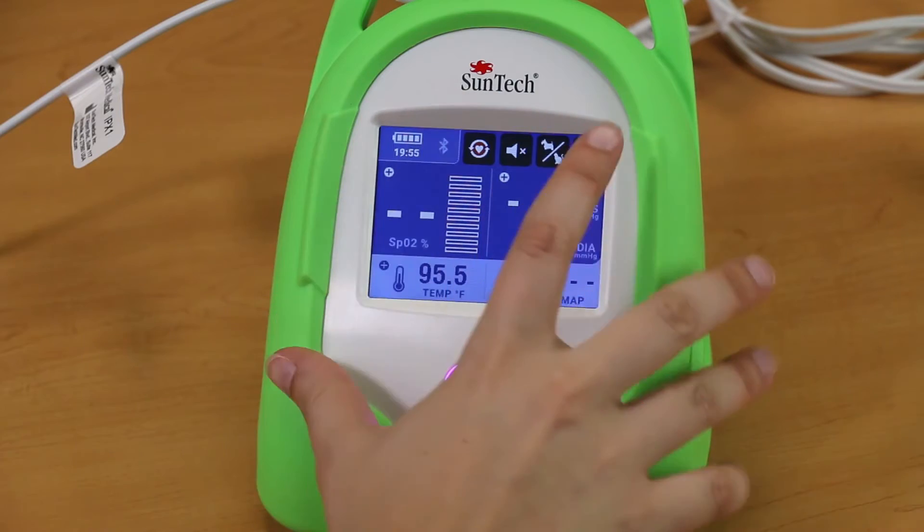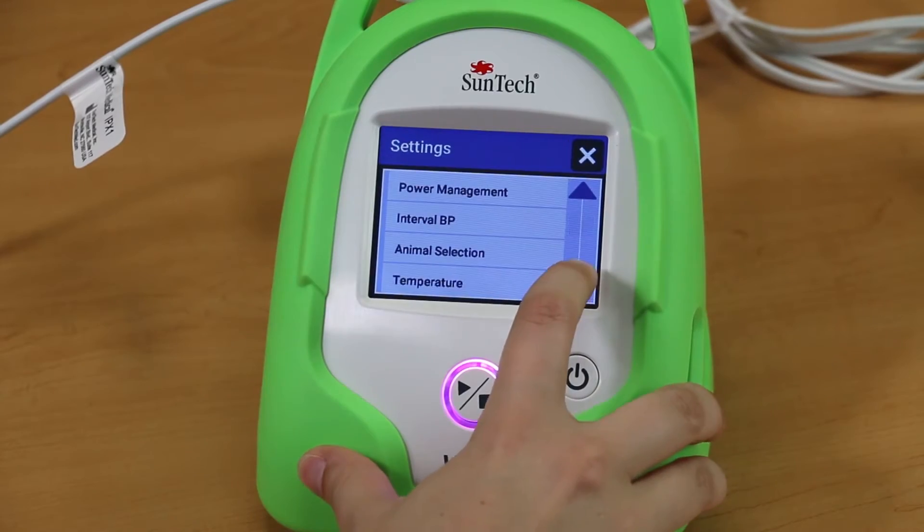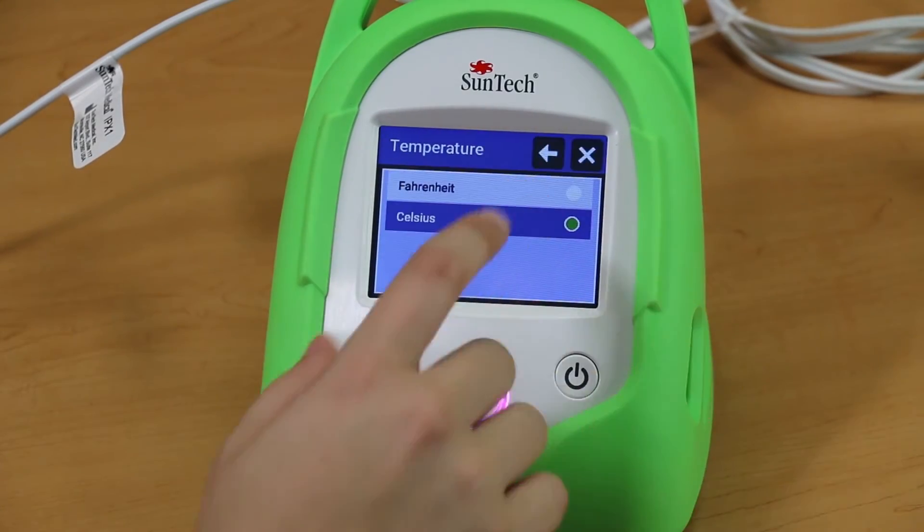To change the temperature units between Fahrenheit and Celsius, press the Menu button, then the Settings button. Select Temperature and choose the preferred unit of measure.